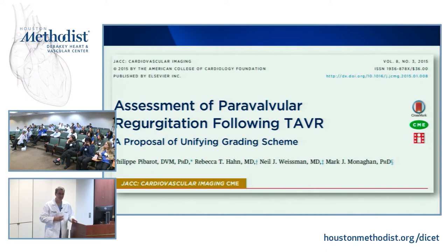Okay. So there is a publication from one of the Canadian groups where they looked at patients post-TAVR, and they found that a regurgitant fraction of more than 30 was correlated with a bad outcome. Which is quite more aggressive than what you would do in a regular native AI. Exactly. Yeah. Right. And probably because these are stiff ventricles, and their ability to tolerate even a small amount of regurgitation is not as high. Makes sense. So that's one thing. And a regurgitant fraction of 30 goes well with moderate.